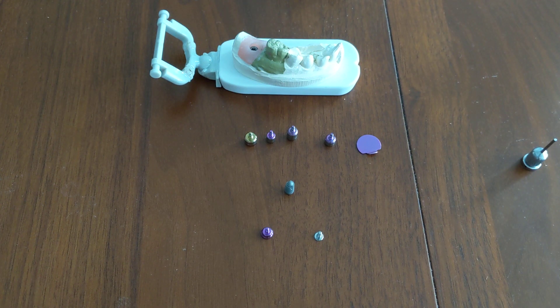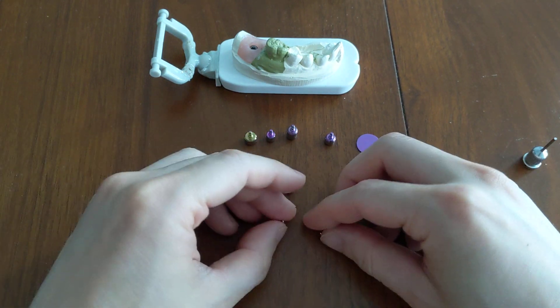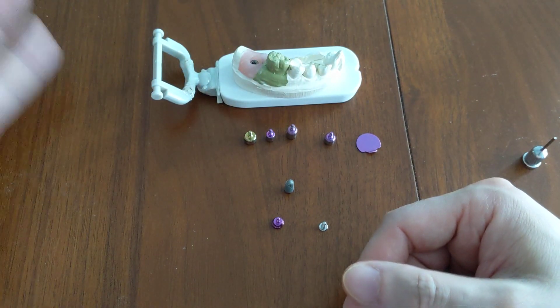Healing abutment versus cover screw — what are the differences? I'll show you how they look compared to each other, how they look on the implant, and a simulation of what they would look like in the mouth.